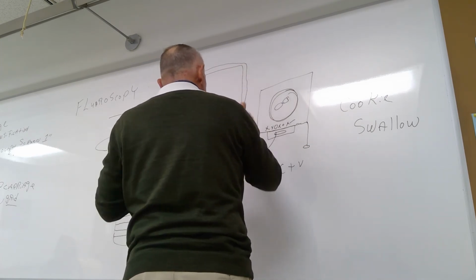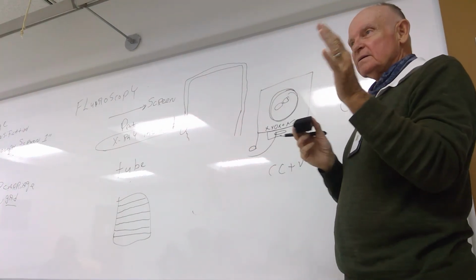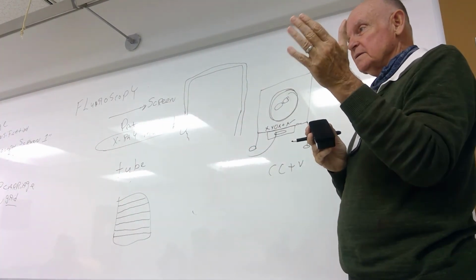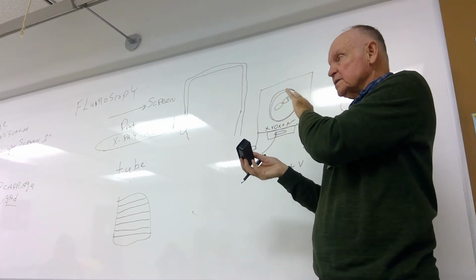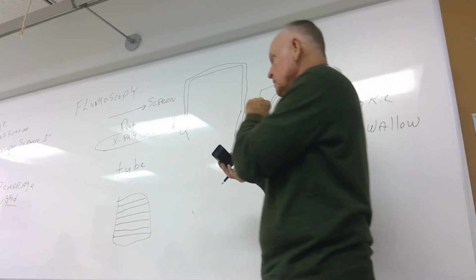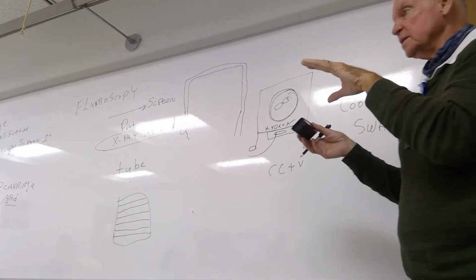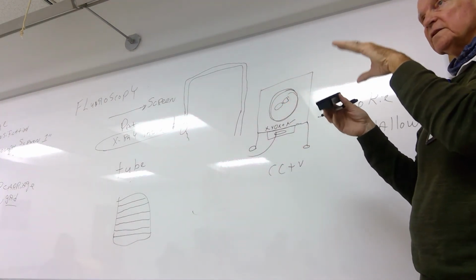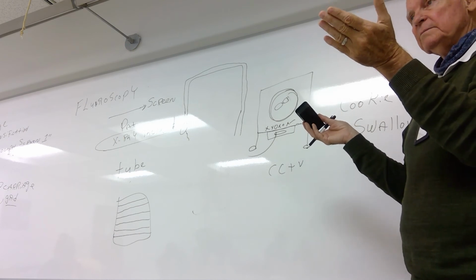Now, in the descending colon, you know what diverticulosis is? You're going to see a ton of that. Keep in mind, this colon, to see these things, has to have barium in it. So you'll see a spattering of diverticulosis, especially in older people. That's just kind of an incidental finding, unless it's bothering them.